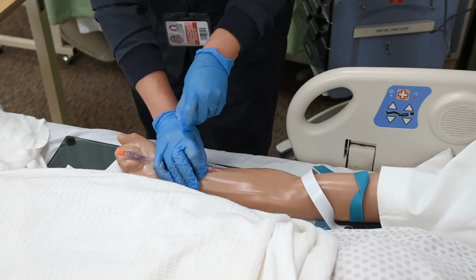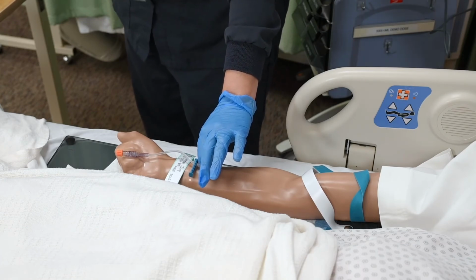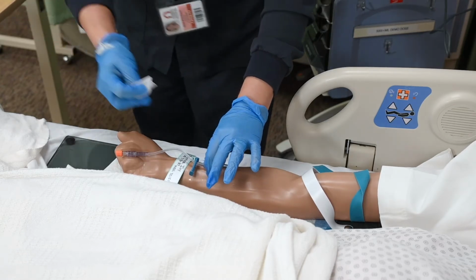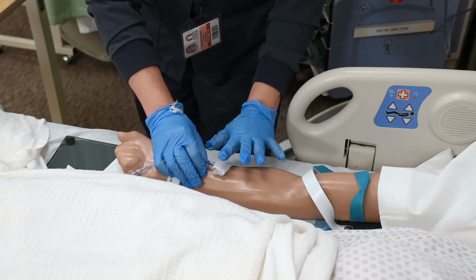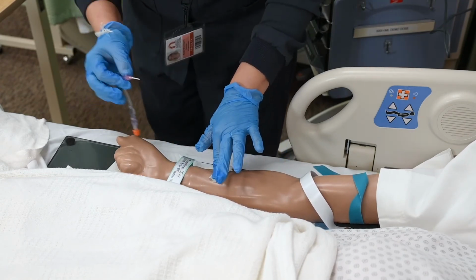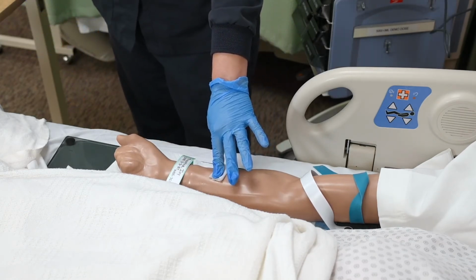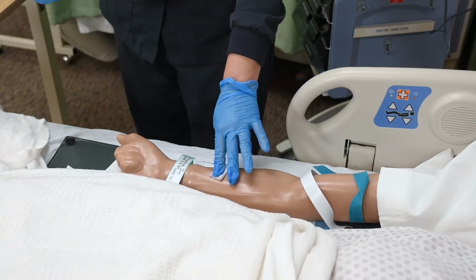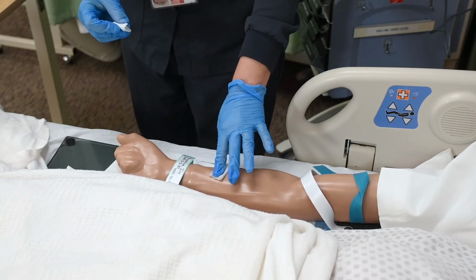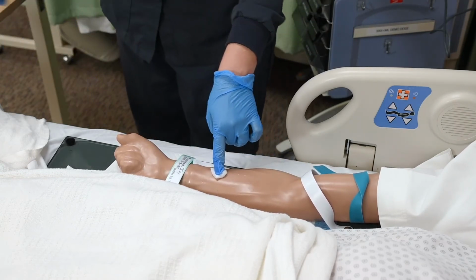Advise the patient you will be removing the catheter. I'm going to be removing your catheter now. Put a 2x2 gauze over the insertion site without applying pressure. Remove the IV catheter. Inspect it for intactness. Apply pressure to the site with a 2x2 gauze for a minimum of 2 to 3 minutes. Then apply a sterile 2x2 gauze dressing with tape. 2 to 3 minutes has passed.